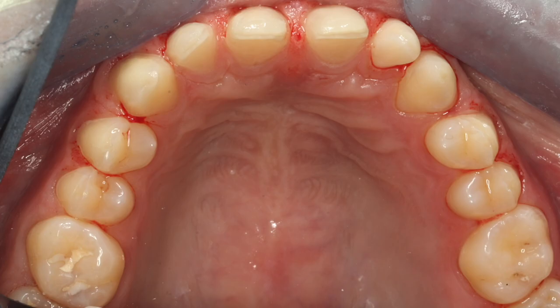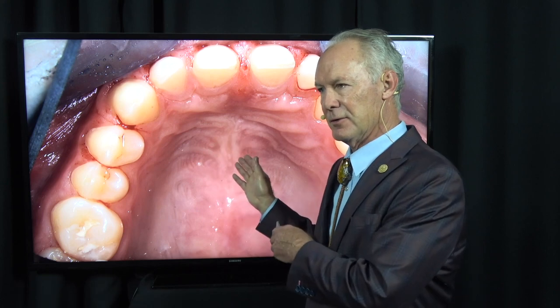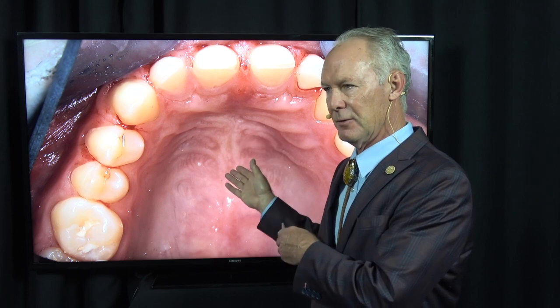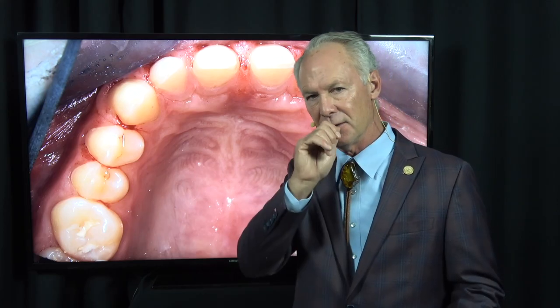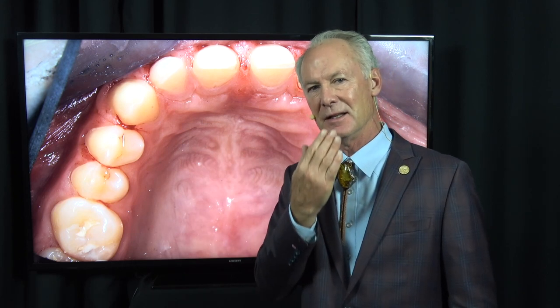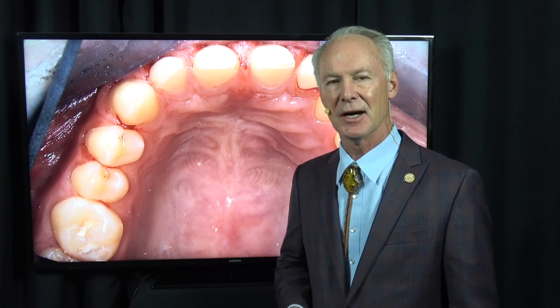So I tell all of my patients, even patients without veneers, don't bite anything harder than a hamburger or a tuna fish sandwich with your front teeth. Veneers are as strong as natural teeth if you prepare them and seat them the way I'm going to show you how to seat them. But even with natural teeth, we have two or three people a week come into our office with fractured incisal edges of anterior teeth from biting something hard, especially if they don't have a night guard and they've worn their teeth and they've got that thin incisal edge from grinding their teeth.